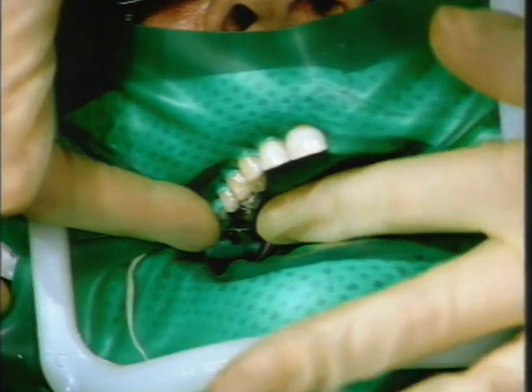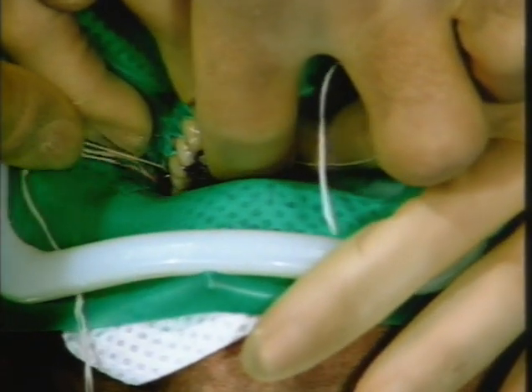So most of those contacts have gone down without any particular difficulty. It's necessary to floss between the molars, and it's easier if the dentist manipulates the actual floss, because he's got the best view. I think that's gone down all right.